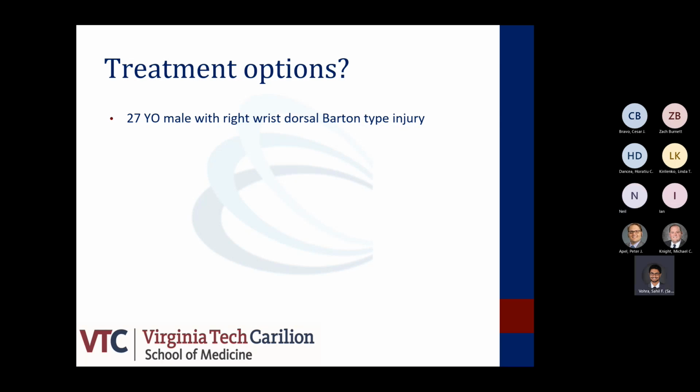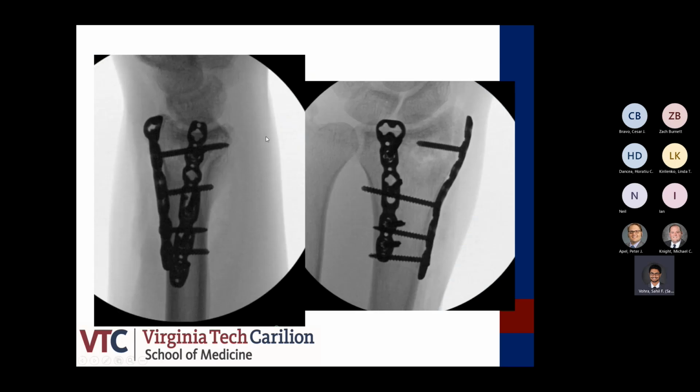Yeah, I think those are good thoughts. So that's kind of what we did in this case. We had planned initially to go dorsal and do all of our work dorsally, because that's where all the comminution and fracture was. So first, I think we applied our dorsal plate here and booked open the fracture, and then there was that free fragment centrally that we elevated up with the freer and then held in place once we booked it open.